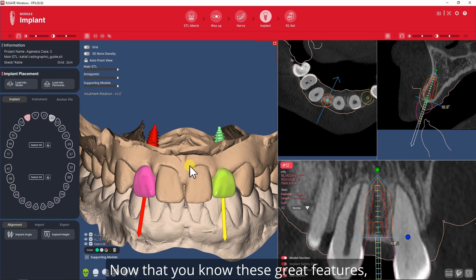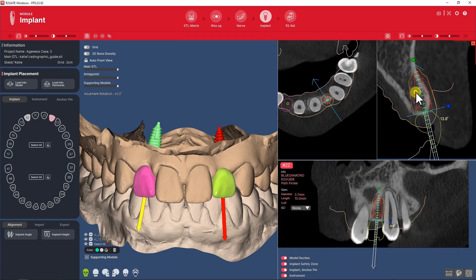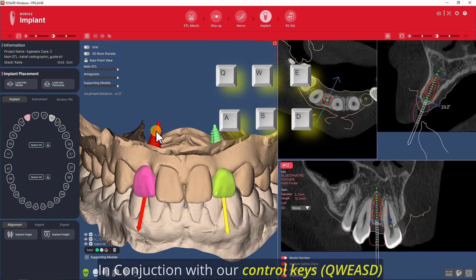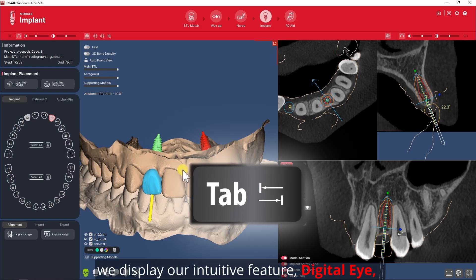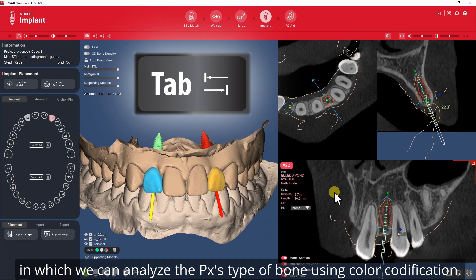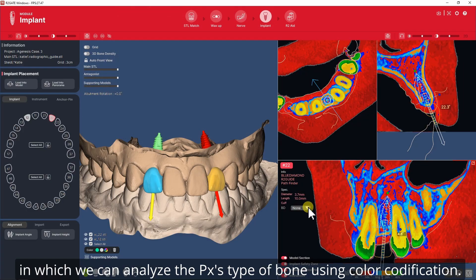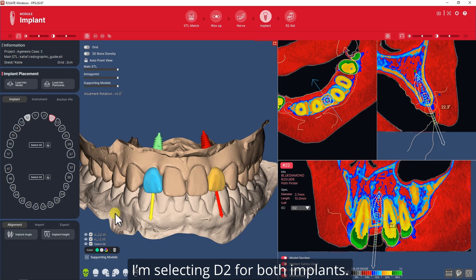Now that you know these great features, let's customize the bilateral implant angulations in conjunction with our control keys. By pressing the Tab key we display our intuitive feature Digital Eye, in which we can analyze the patient's type of bone using color codification. Let's assign the bone density — I'm selecting D2 for both implants.